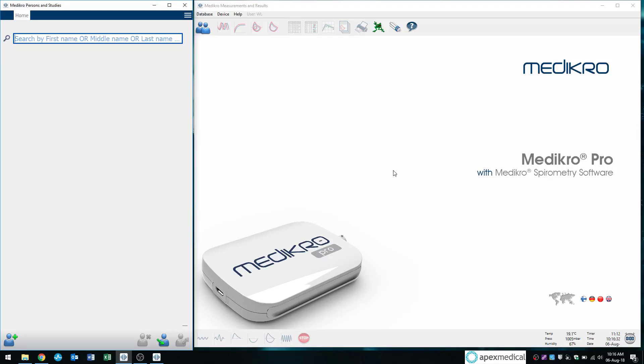Hey everyone, this is Wilson from Apex Medical. This is our second video on how to perform spirometry using the Medikro spirometry software.